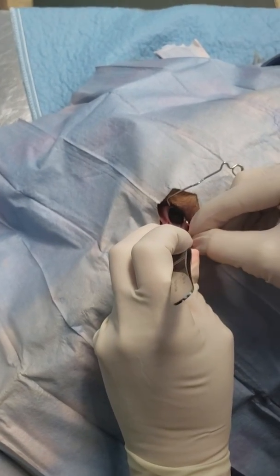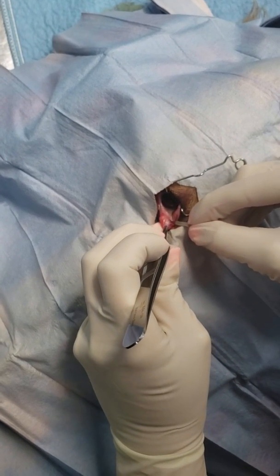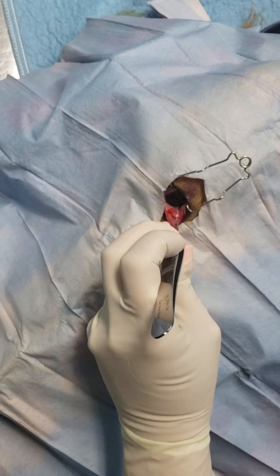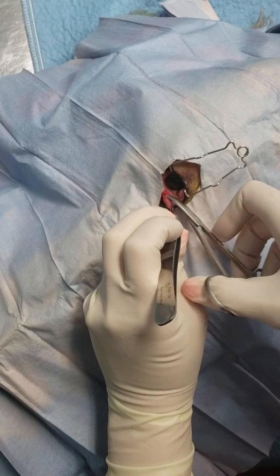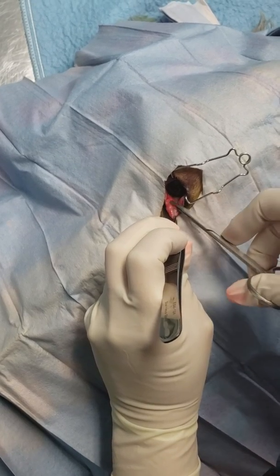You want to make an incision on either side of the cherry eye through the top layer, and then you take your iris scissors to bluntly dissect under that pocket, just to give you some depth to your pocket.